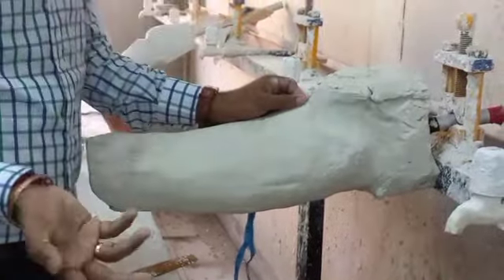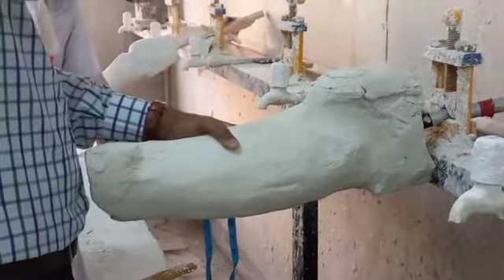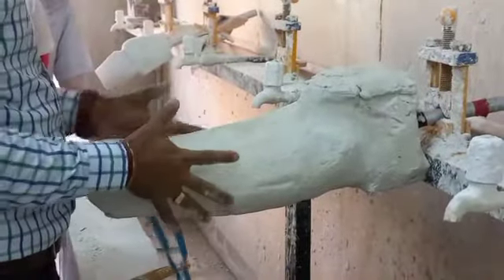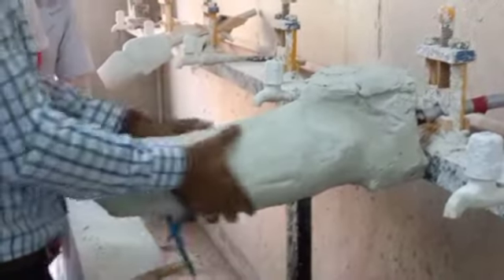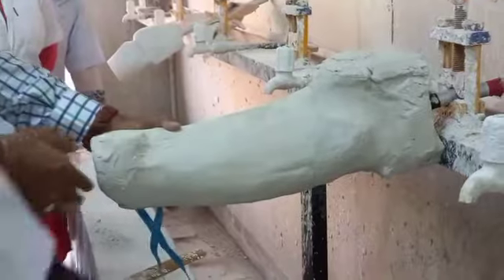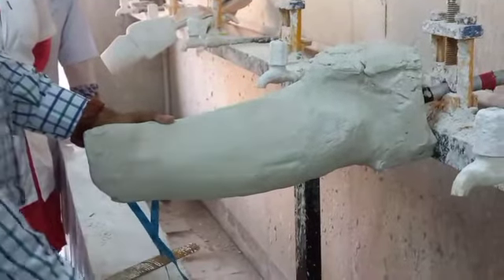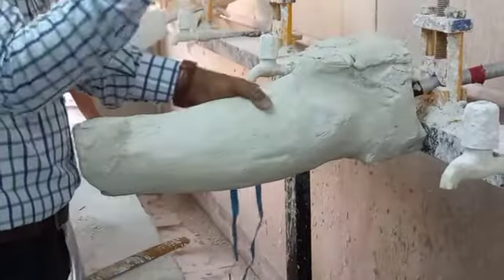That will be larger, because we know it is going to fill. Once you fill with the plaster, this portion swells more because it's more open, right? This portion is closed, so normally you will find that this area has lesser volume change, but in the proximal area you will find that the volume will be larger than the volume you have taken over the patient.